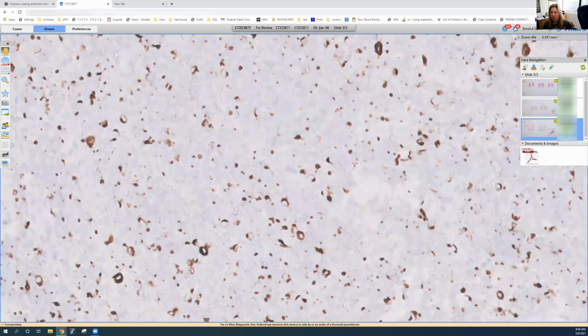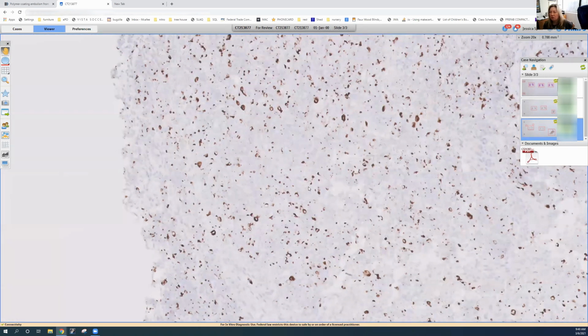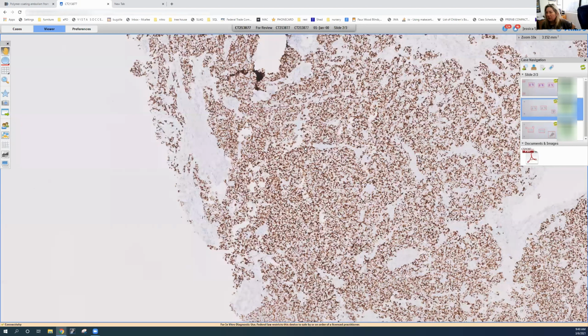And you can see it has a similar staining pattern to the cytokeratin 20 with these dot-like paranuclear staining. When you get cytokeratin 20 staining, that's basically diagnostic of primary Merkel cell carcinoma of the skin and essentially excludes a metastasis from a visceral neuroendocrine carcinoma.